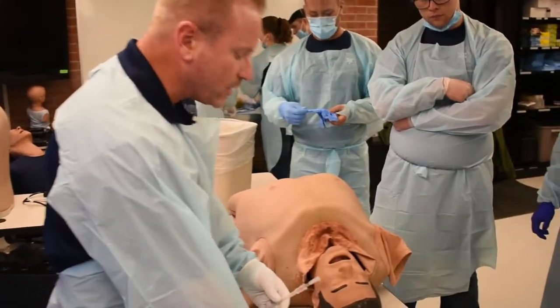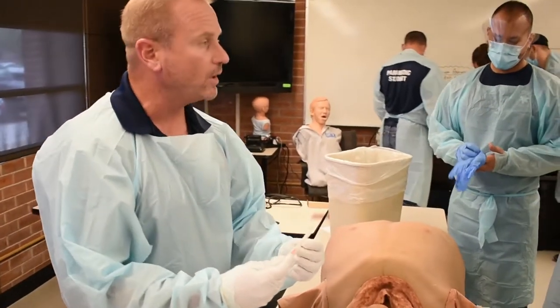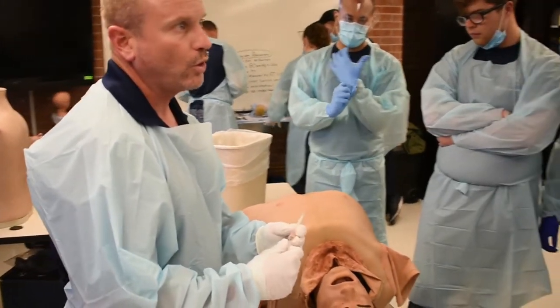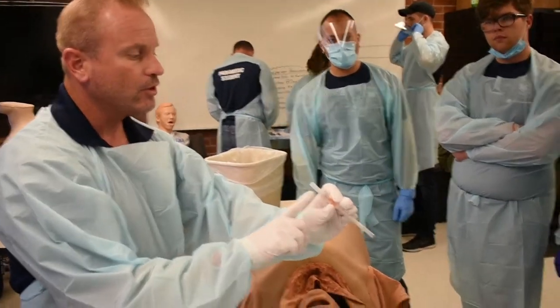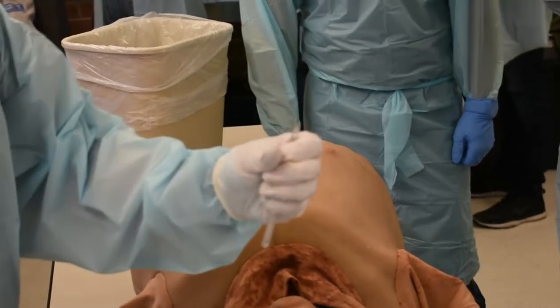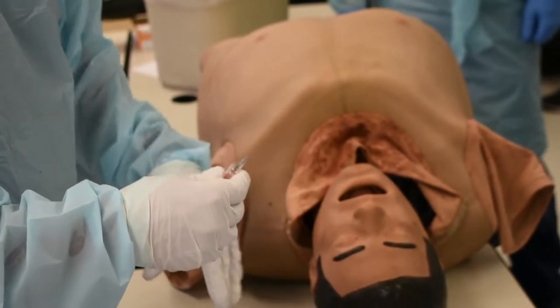I use an ARS needle — an air releasing system needle. It's a 14 by 3¼. You want to use a 14 gauge by 3¼ inch catheter or a 12 gauge by 3¼ inch catheter. You need the length. Most of the 14 gauges come with a backing on it. This will not release any air until you pull off the back. You can also get the ones called ARSs — air releasing system.